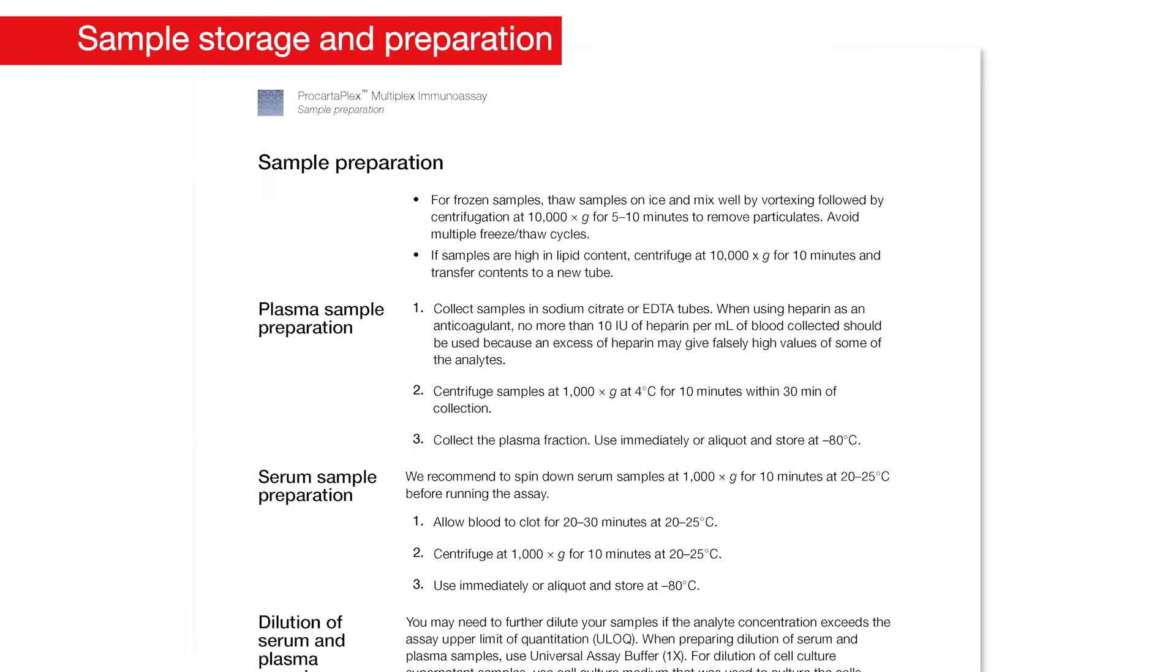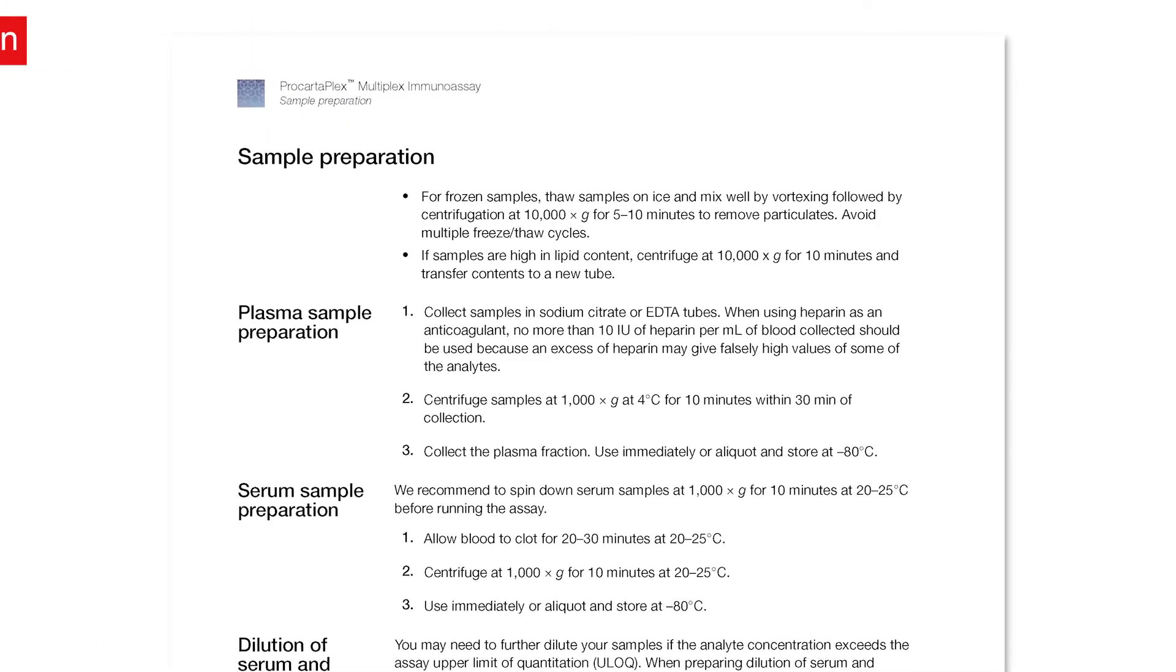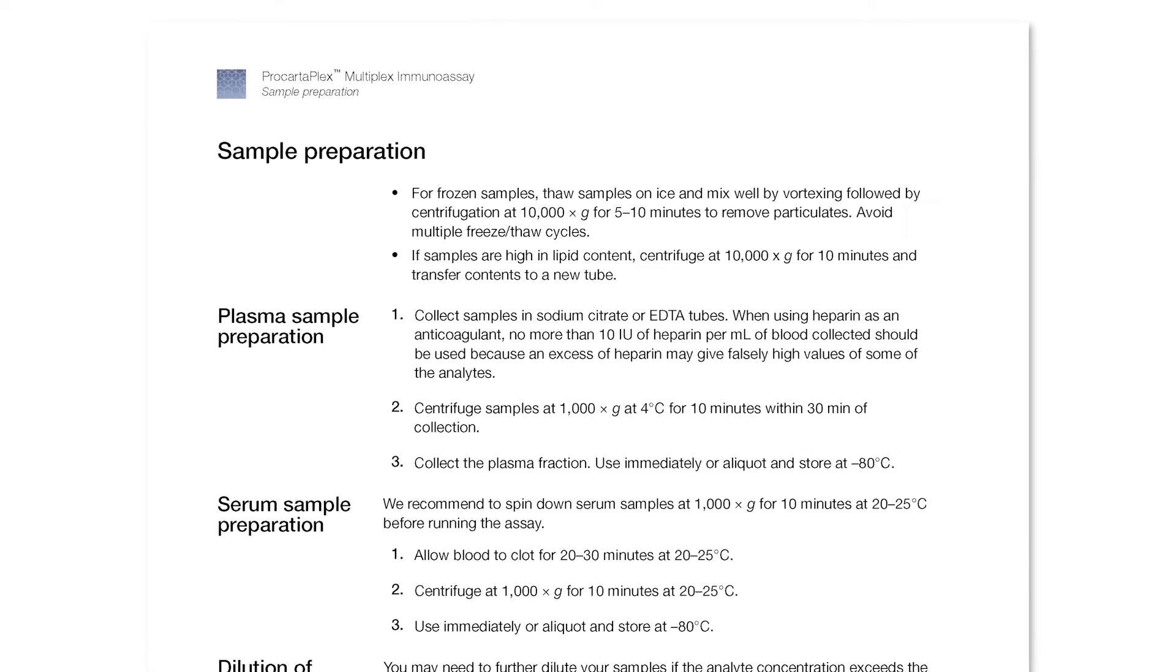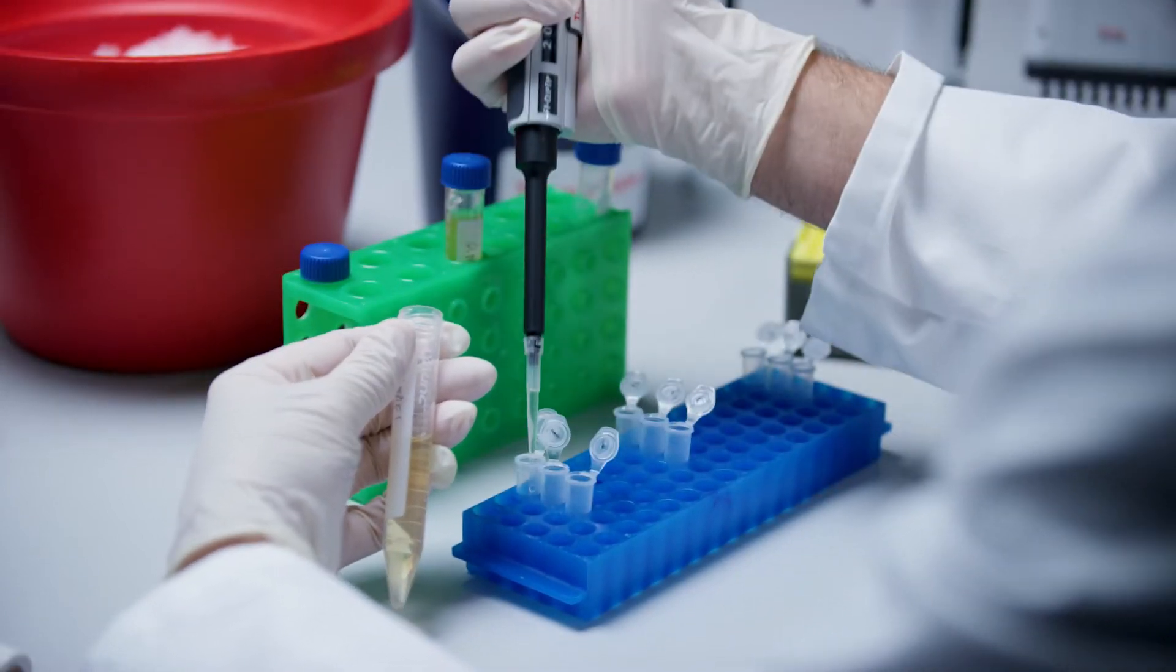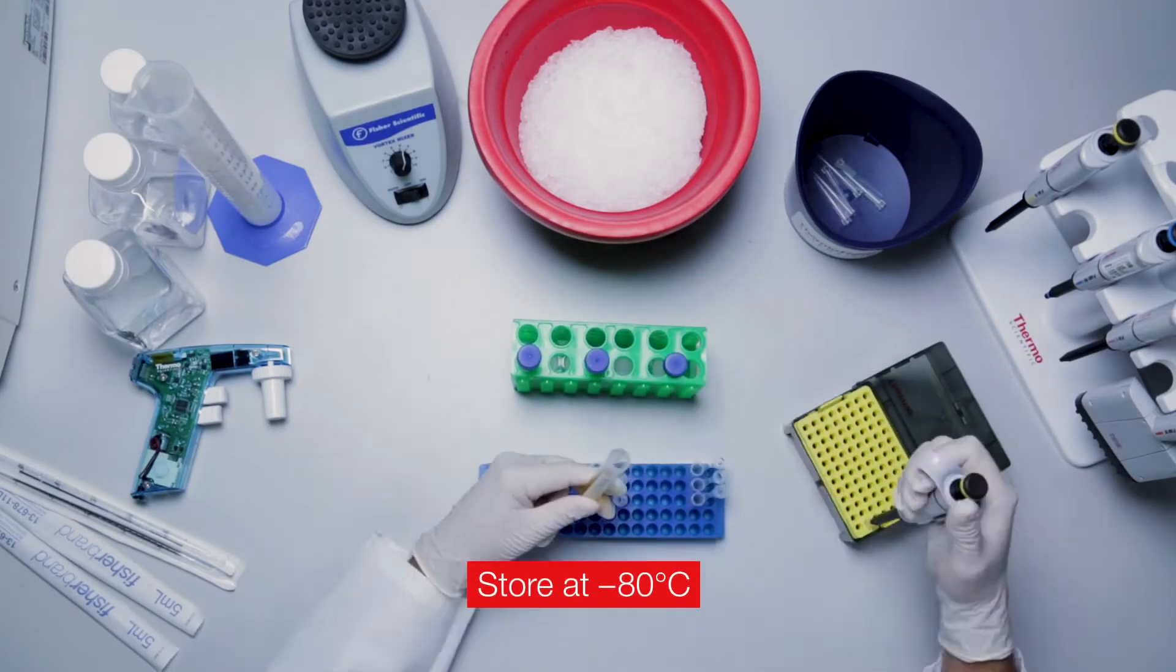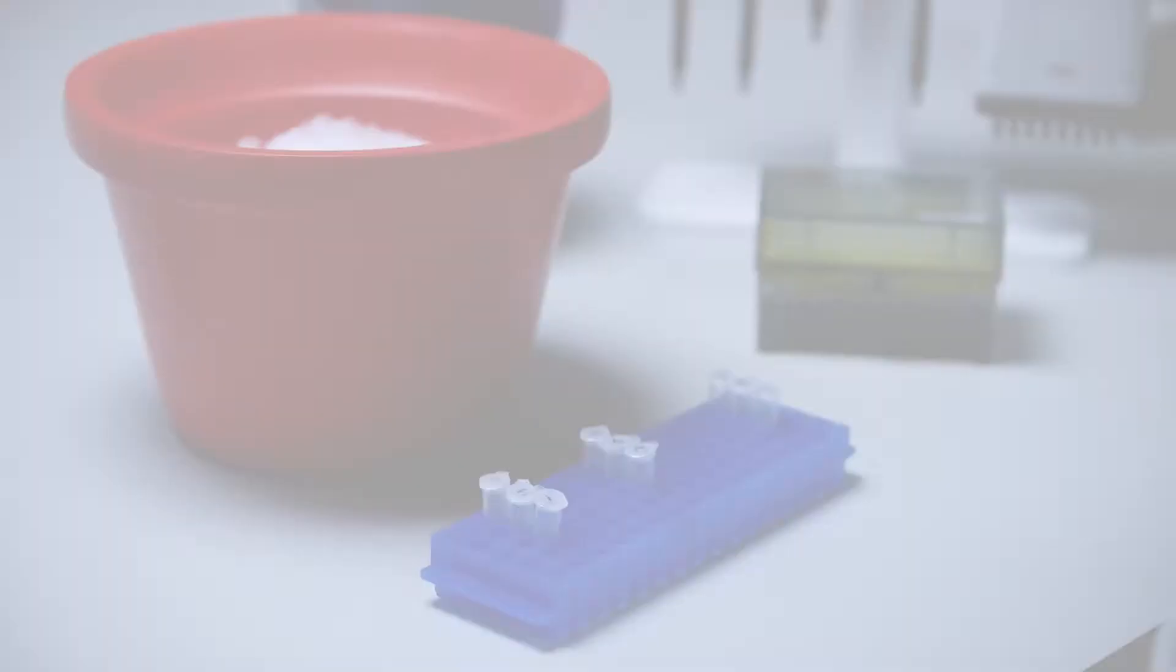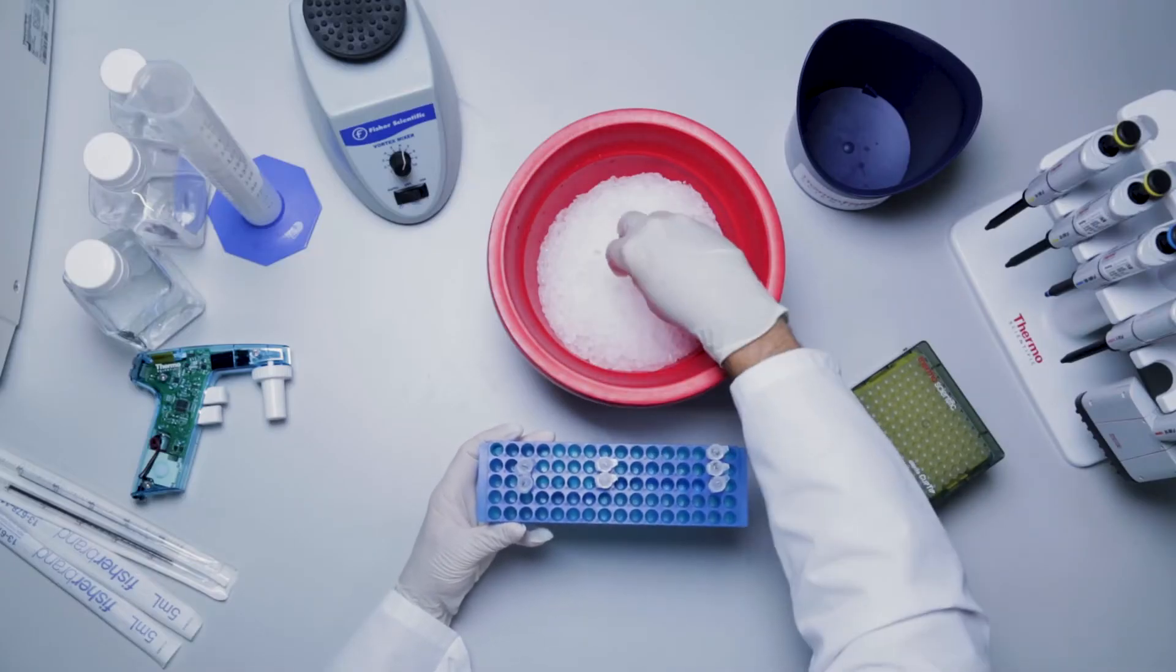Serum and plasma samples should be prepared using established protocols. Refer to the sample preparation section of your ProCartaPlex assay user guide. If the samples are not used immediately, aliquot the samples and store at -80°C. Before running the assay, remove the samples from the freezer and thaw them on ice.